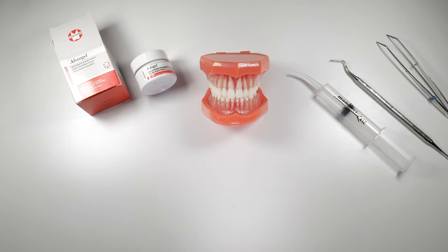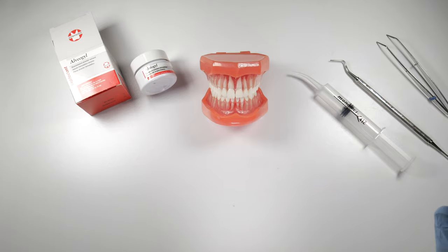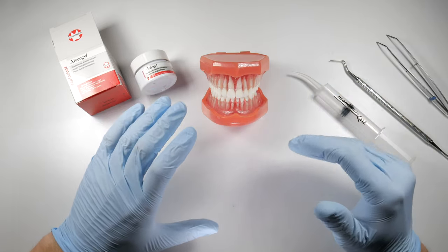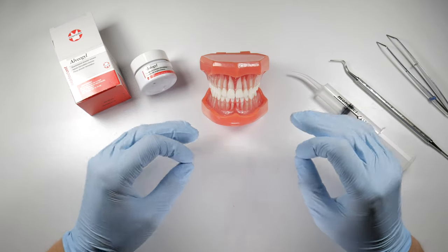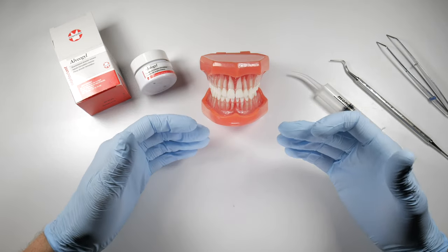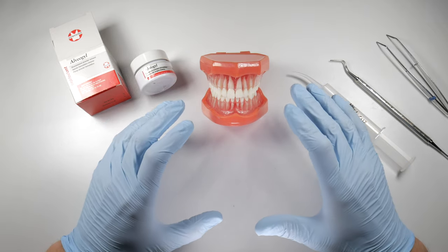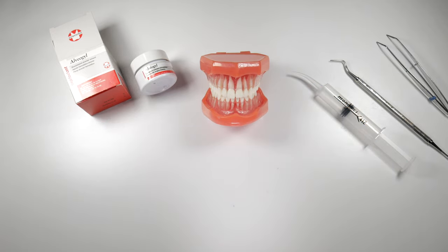When you irrigate these things, they can be a little bit touchy, so make sure you let the patient know that beforehand. If you do irrigate it and it gets a little bit sensitive, that is again some confirmation that what you're dealing with is in fact a dry socket.